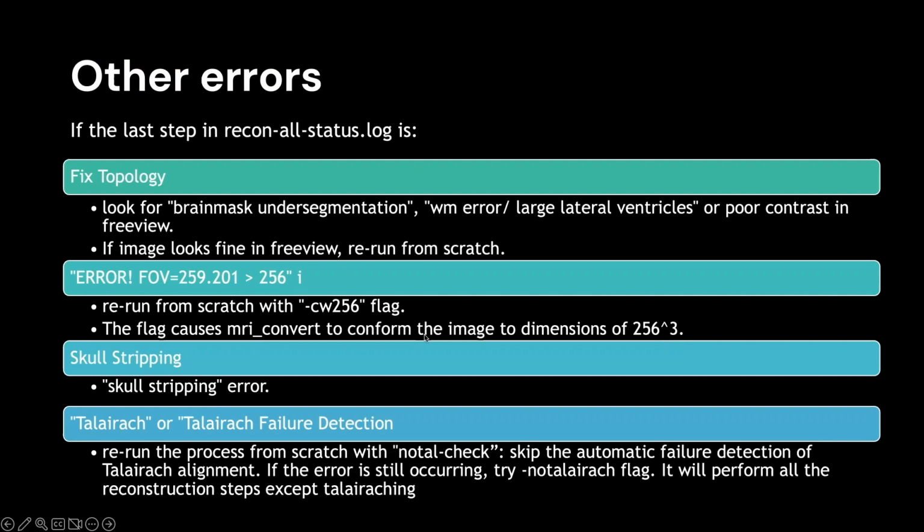Finally, the FreeSurfer documentation has an extensive section on troubleshooting with some examples and ways to fix them. So I would encourage you, if you're having lots of troubles with a particular subject, to just go and check the documentation and make sure that you're implementing the correct commands.